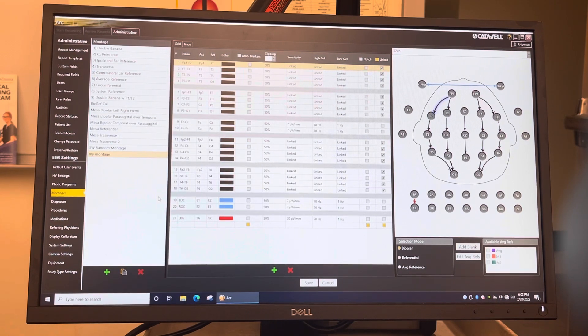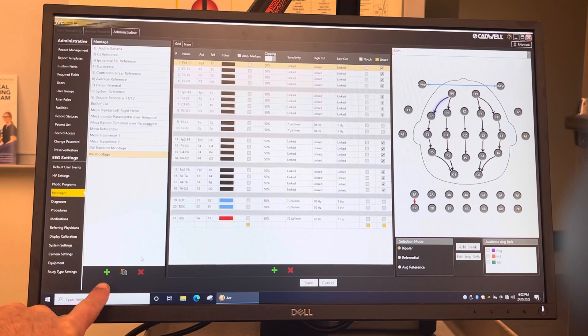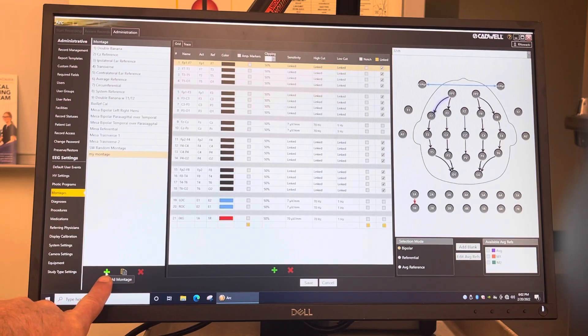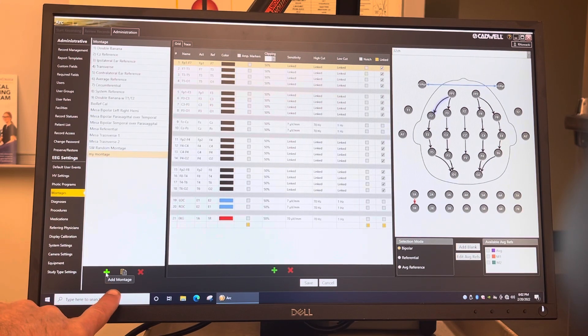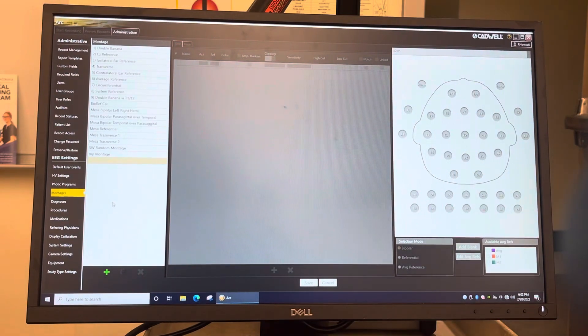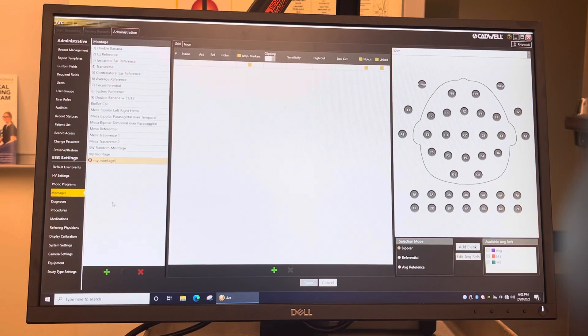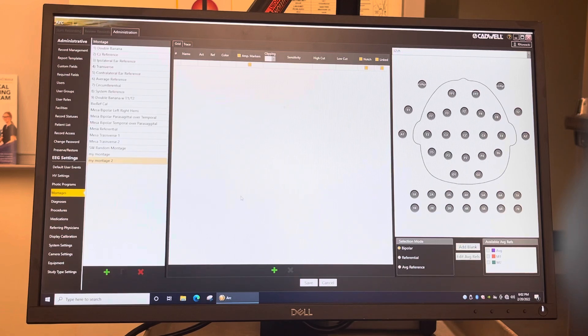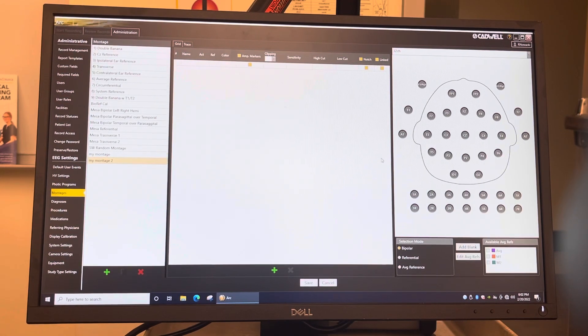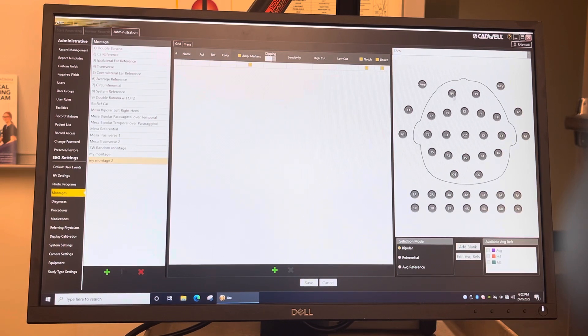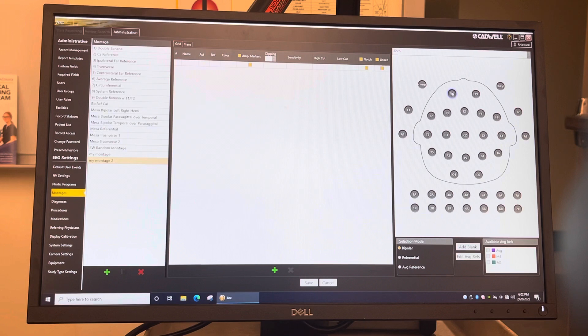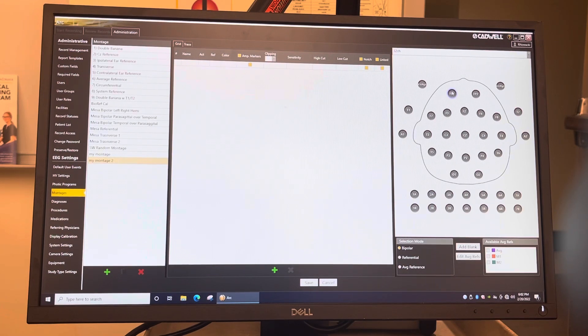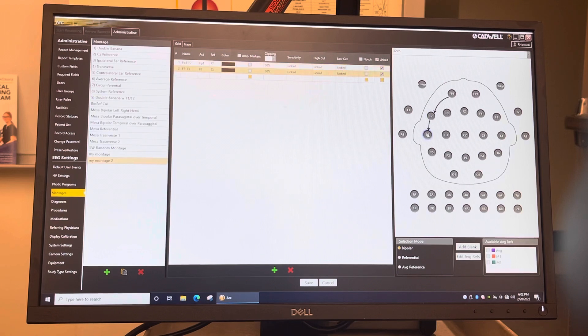Now if you want to create one from scratch, what you do is you click on this little plus sign here, Add montage. It's going to be my montage two. So what you do is you go over to this head diagram here. And you just click and drag from one electrode to the next, just like the Natus one.